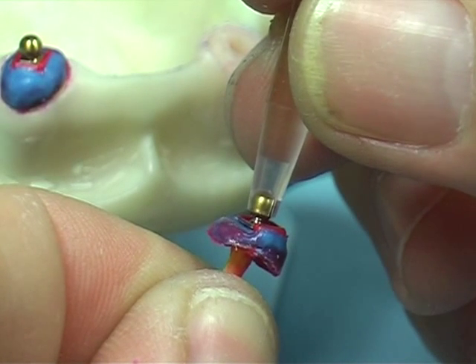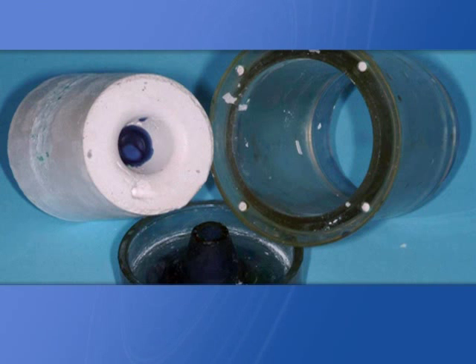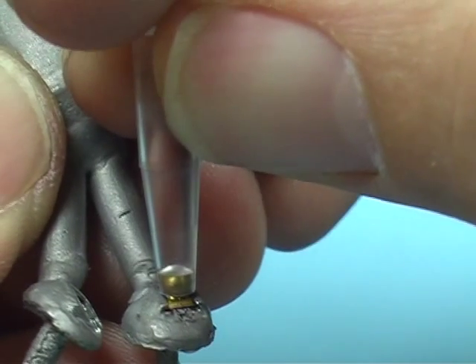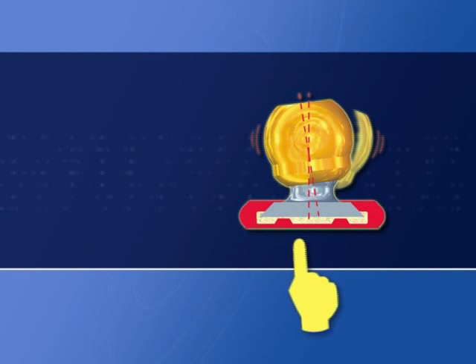Pull out the sphere from the base, sprue and cast it. After casting has been sandblasted, use an old burr and sharpen its tip needle-like in order to refine the base's frame corners without wear or altering it. Work on the undercuts and interlocks carefully in order to maintain as much precision as possible.